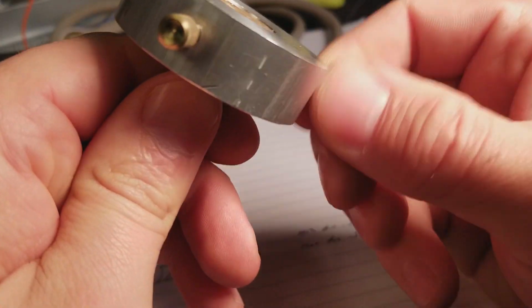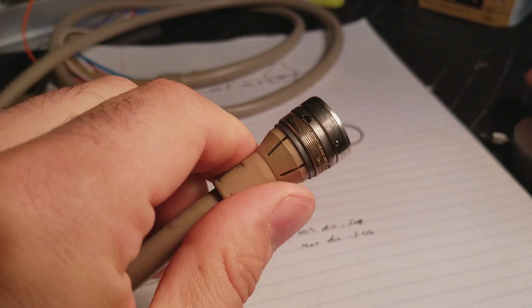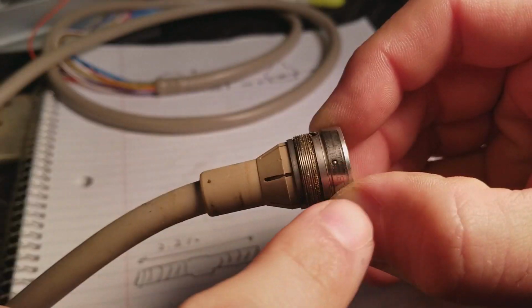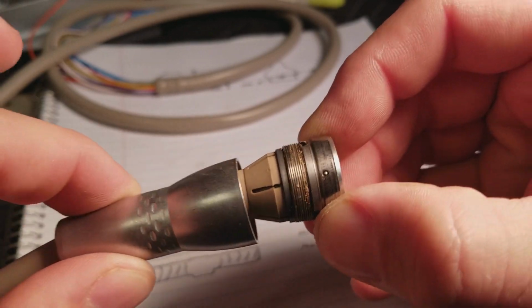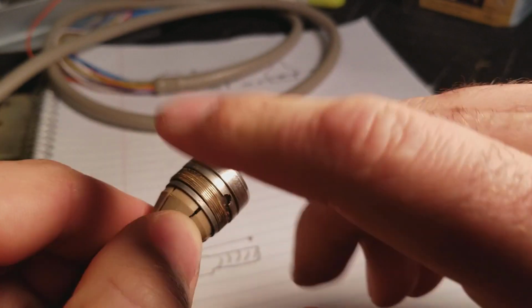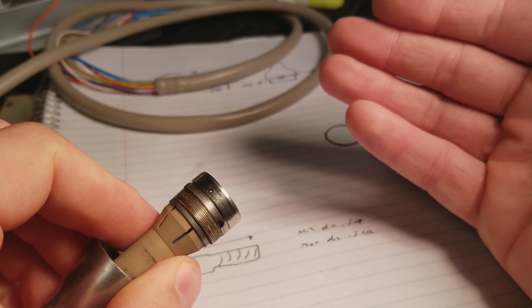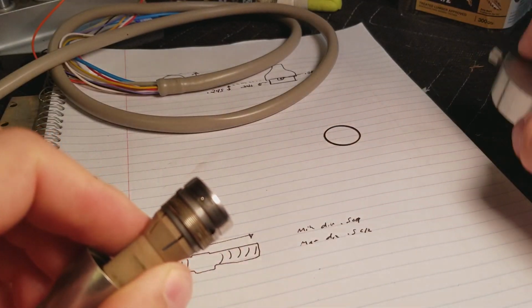Then I just back these off like so. And now you're exposed with this piece here. So this is the actual threaded component that screws into this bottom piece. And this was the piece that was just spinning around and around. So you can see that stuff on the threads there. That was some type of corrosion that made this actually pretty challenging to get off. But with this wrench, I could do it still.